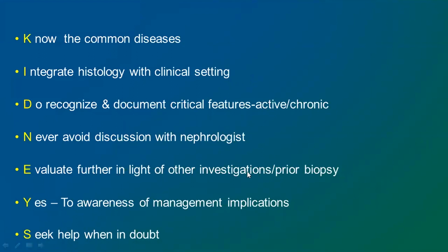Evaluate further in the light of other investigations, not just immunofluorescence and electron microscopy, but other investigations, serologic investigations, or any others in the light of the clinical scenario. If there's a previous biopsy, pull it out and compare it with the findings in the current biopsy, or at least get information about what it showed if it was done at another institute. And be aware, say yes to the awareness of management implications, because your diagnosis is going to guide the clinicians in their decisions. And when in doubt, it's good to seek help.